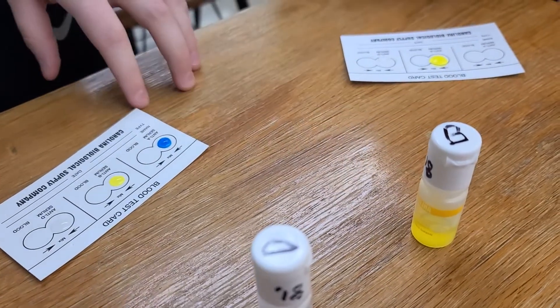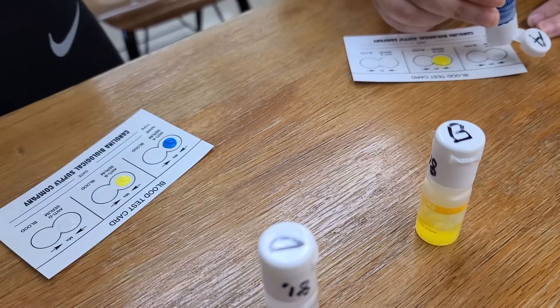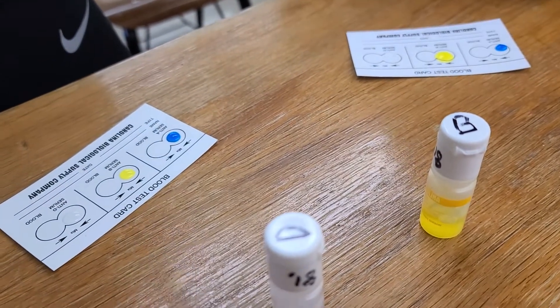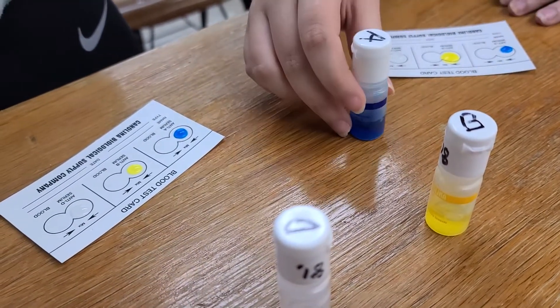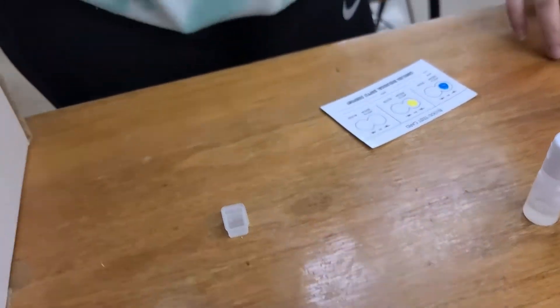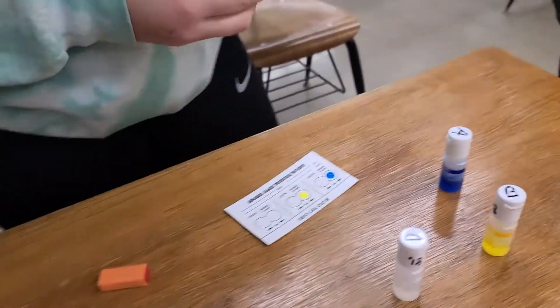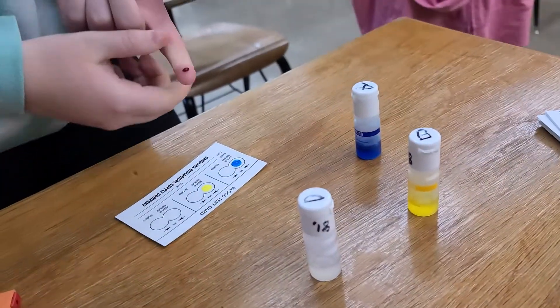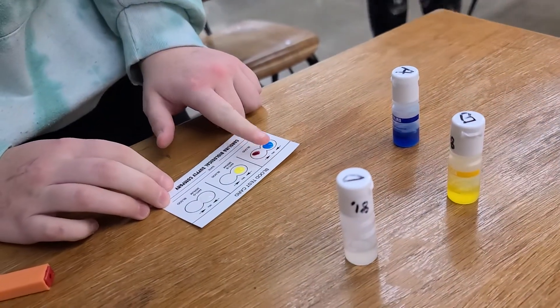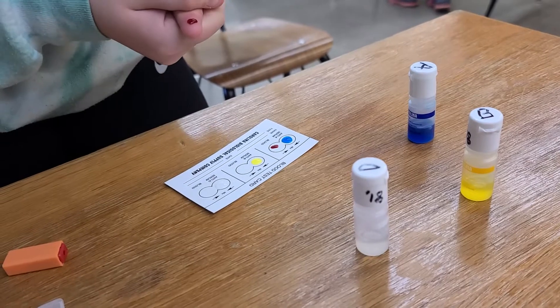Get a little bit smaller next time — there we go. Does everybody have anti-serums in? Just press down on the rod, bring it down a little bit. Push hard. Now pull your blood first. You're doing good, and then try to get a good drop like that. A little bit more always helps.